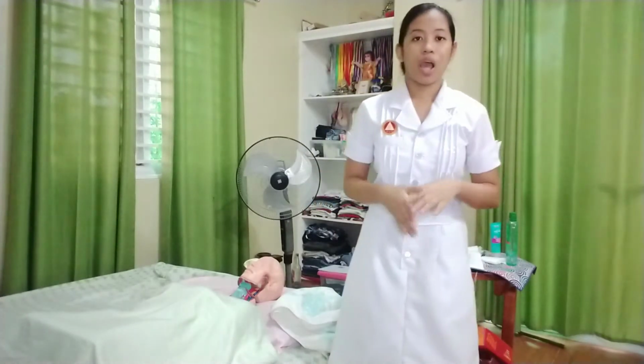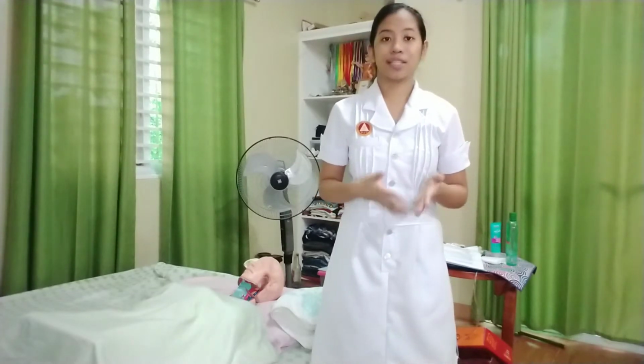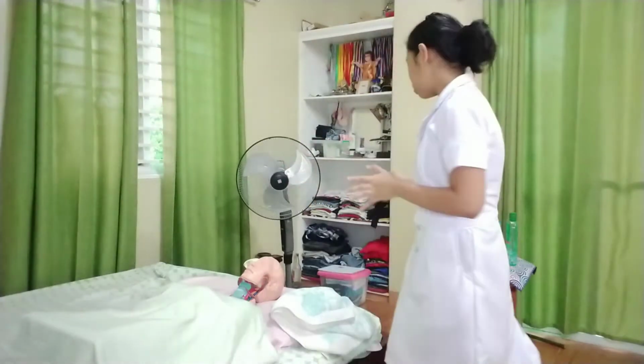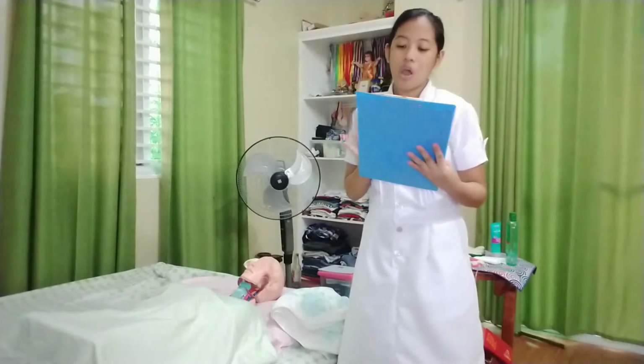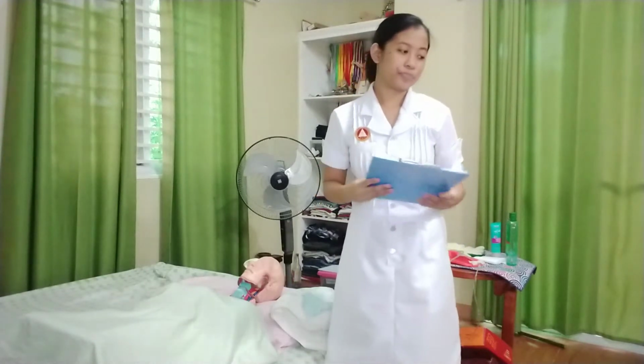So after assessing my client's condition, I will now proceed to planning. I will be identifying any kidney or cardiac diseases that may contraindicate the use of enema, and also I will check the doctor's order for the need of enema. So it states here that the doctor ordered administering enema.